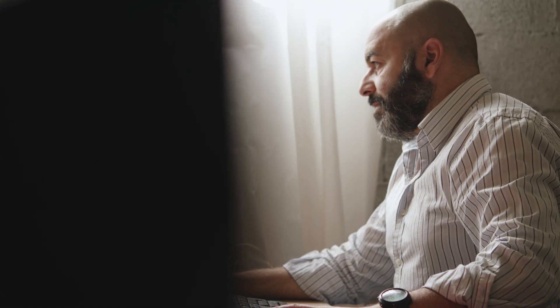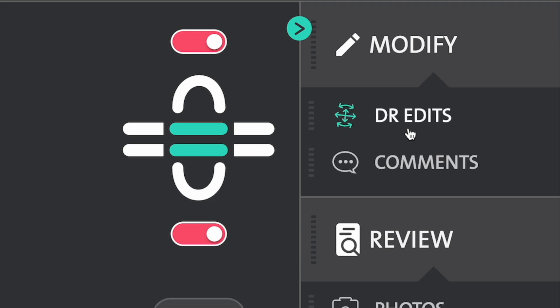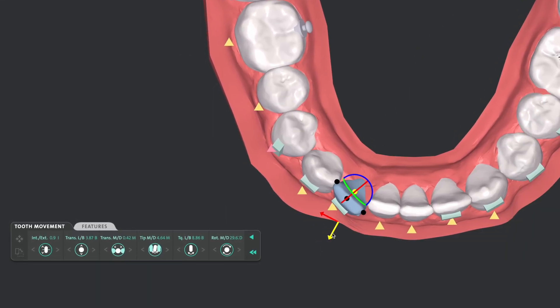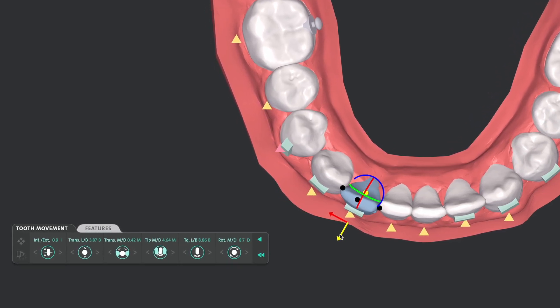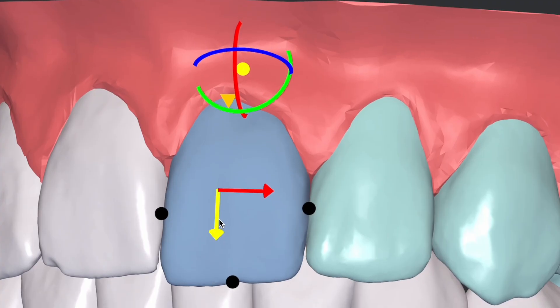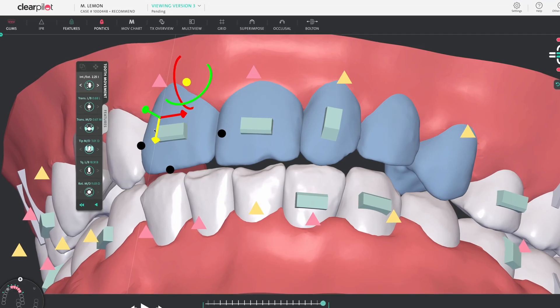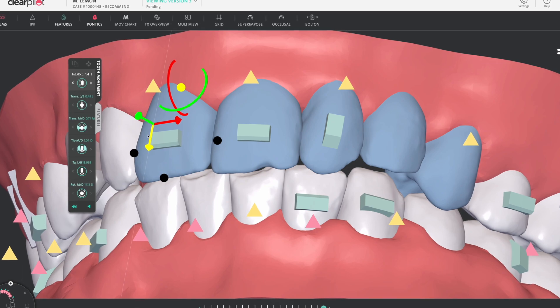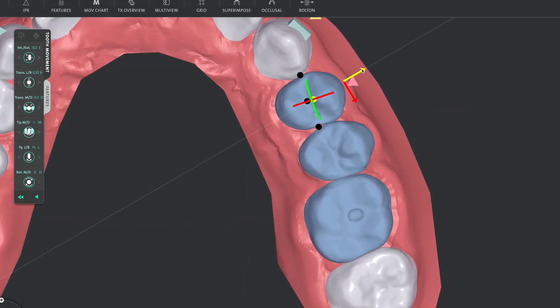If you're a clinician who prefers a more hands-on approach, at ClearPilot's core is its powerful editing tools, including 3D controls to change the final position of the teeth directly on the 3D model. With compass and hotkey editing for individual and group tooth movements, you can prescribe treatment with speed and precision, and the control is always in your hands, right where it belongs.